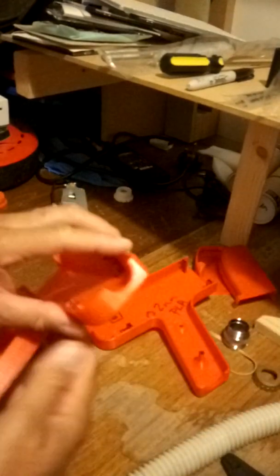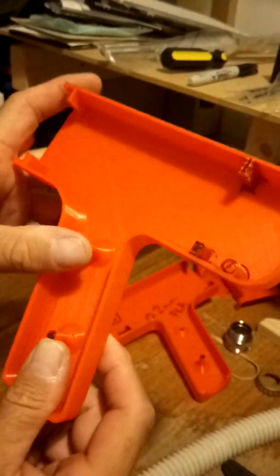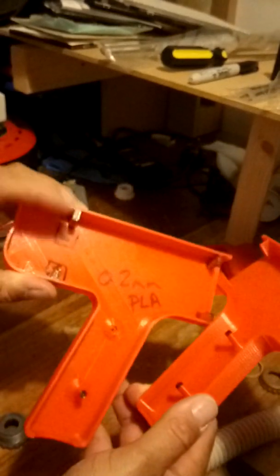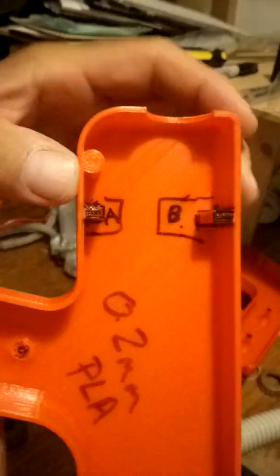Now the problem I'm getting is this. When I made this earlier, we've got these little strengthening bits. This is where a screw's going to go. And these two pieces here, they're just the bits inside. As you manufacture, you see what I mean, like these bits. That's where the screws are going to go on from the other screws, and they're going to screw together like that. You see? So as I'm showing you these bits here, I've marked one of them as the letter A and the other one as the letter B.